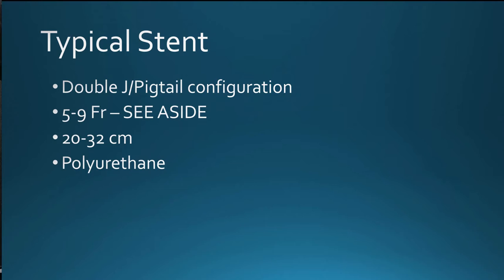There's significant research being done even now to look at improving stent composition, including creating a stent that is less likely to have calcification and bacterial deposition, stents that are peripherally softer and less irritative of the bladder and the collecting system, and even stents that are biodegradable.